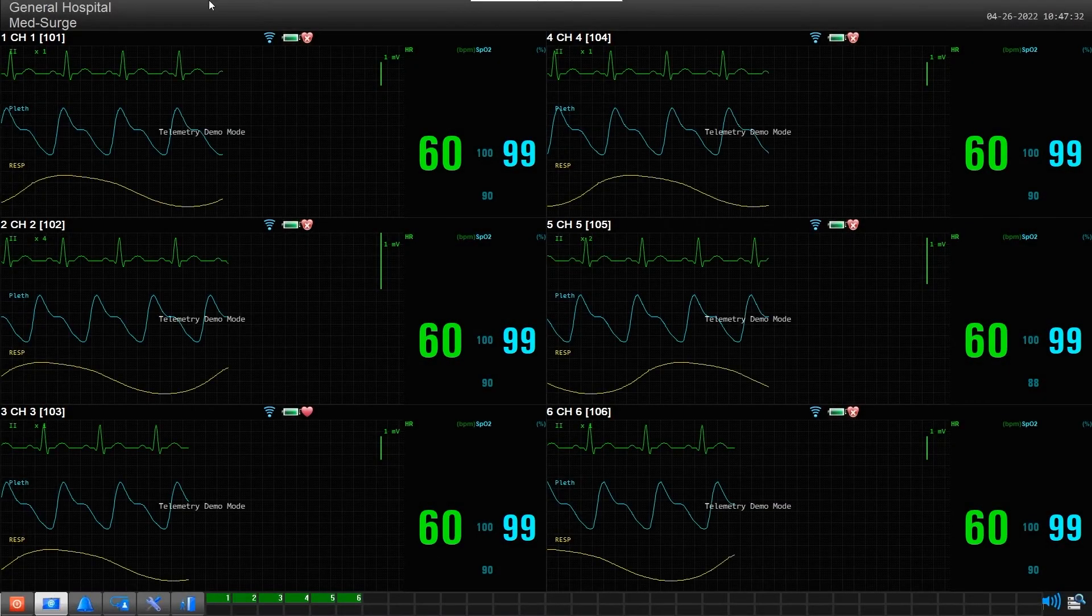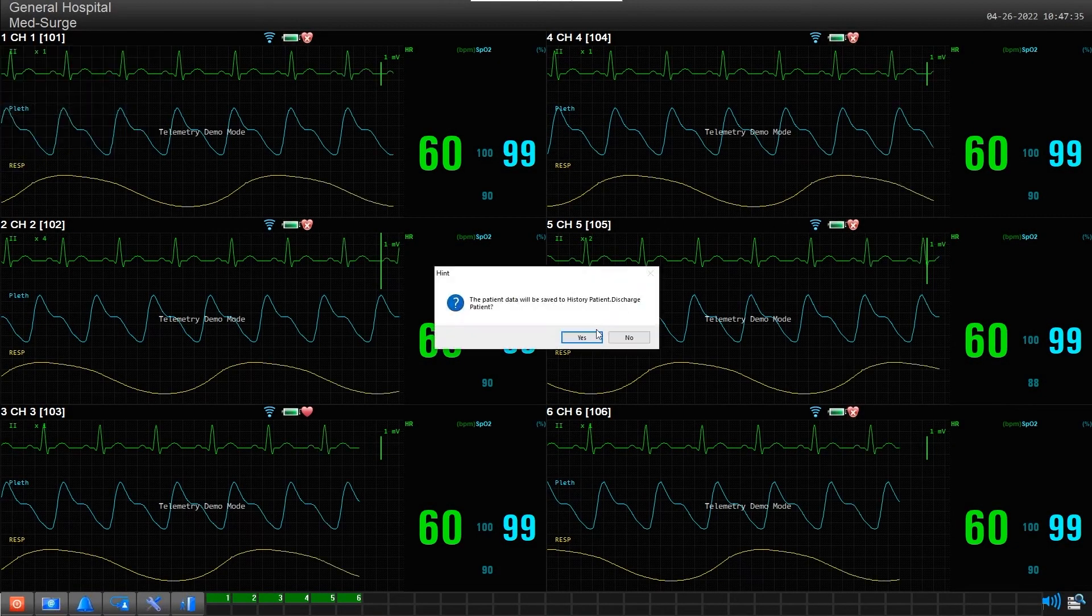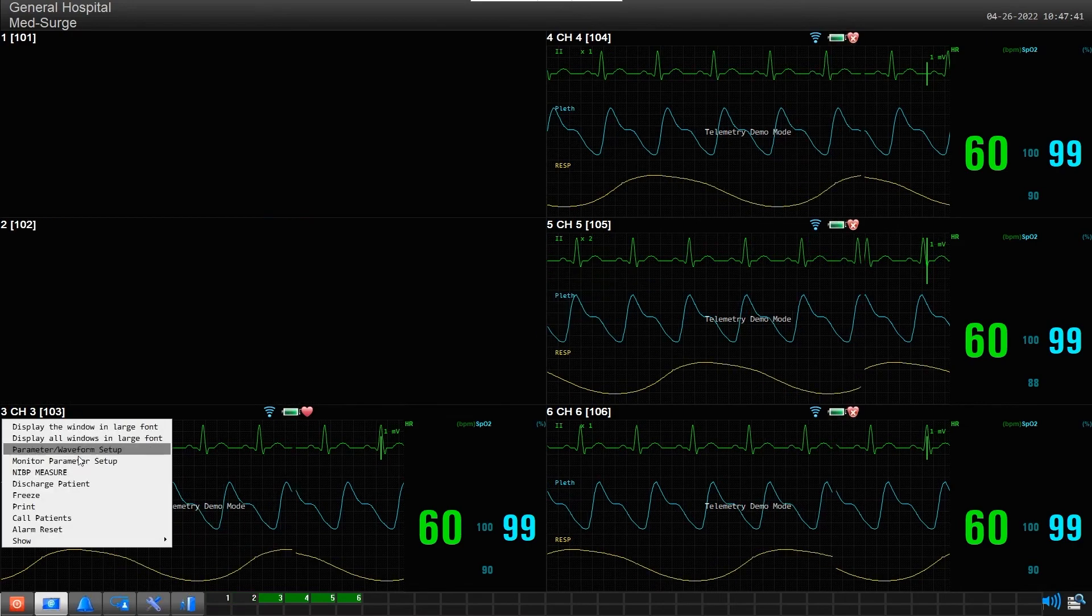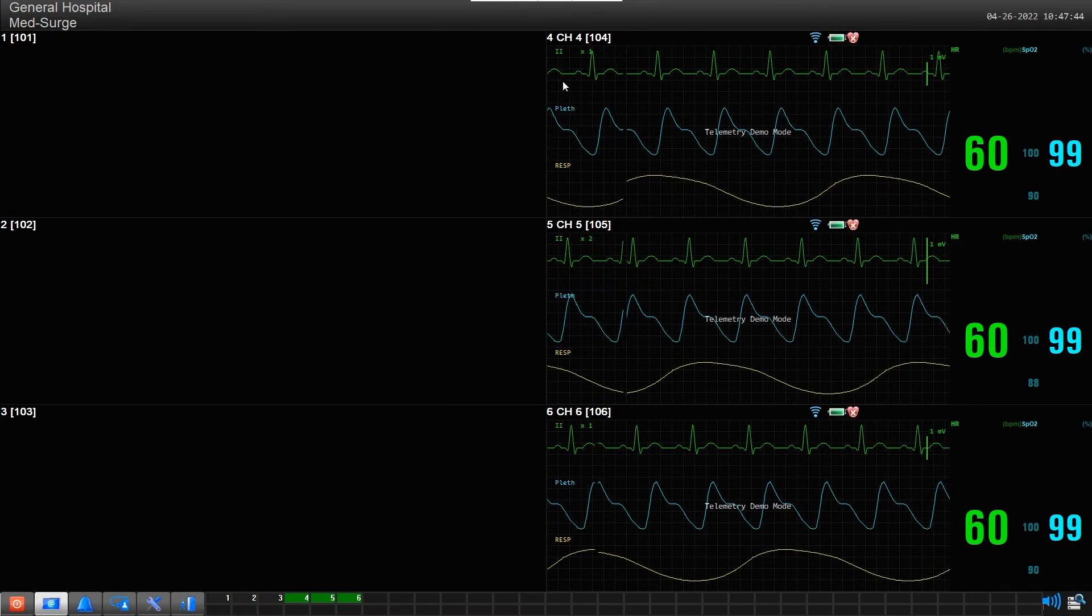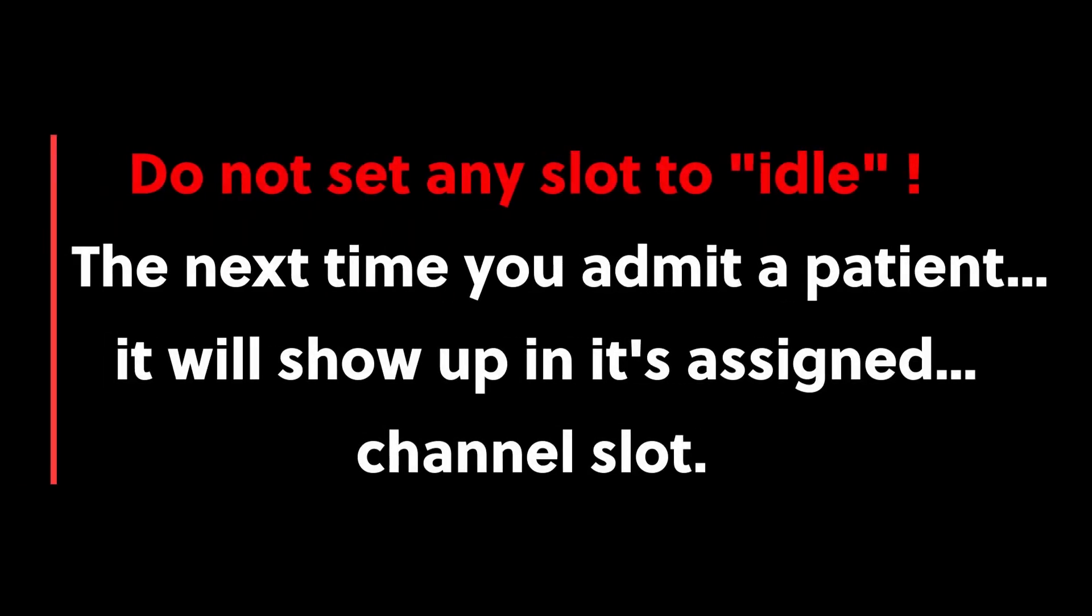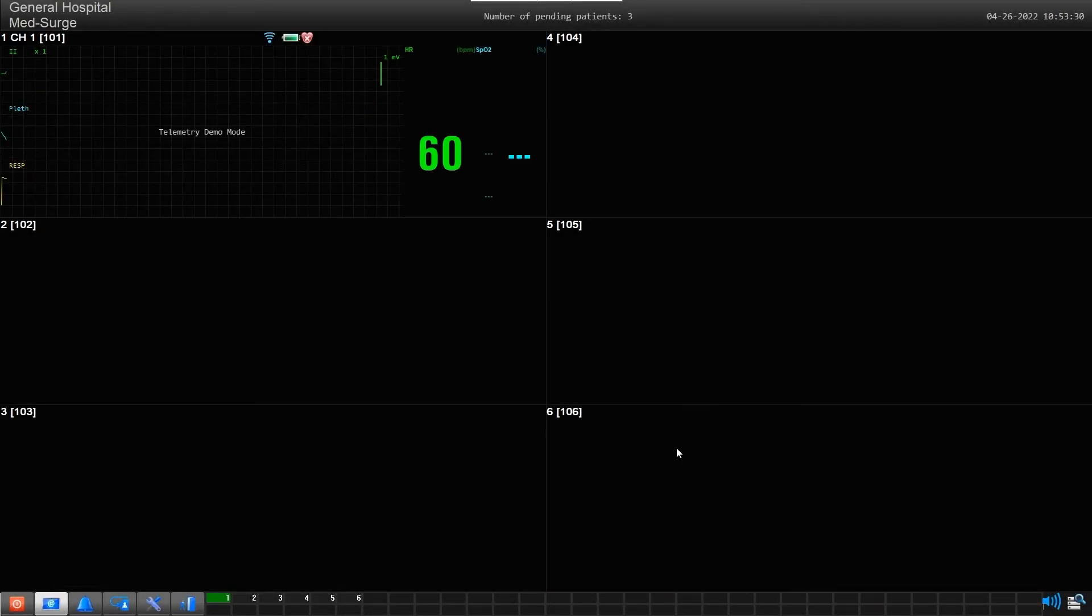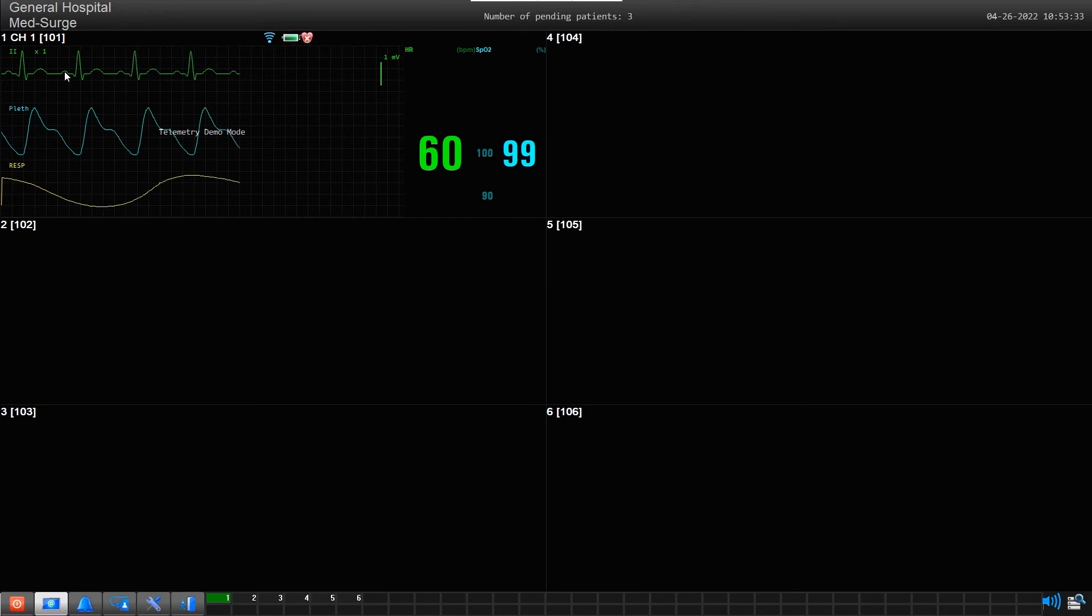Step 3: Now discharge them all one at a time, but do not set any of the channel slots to Idle. The next time you admit one of these channel devices, it will automatically show up in its assigned slot.